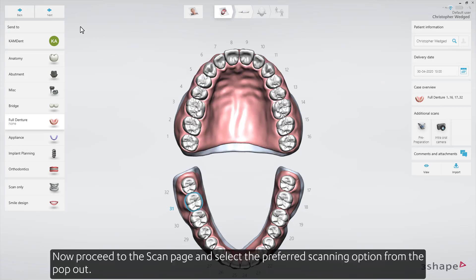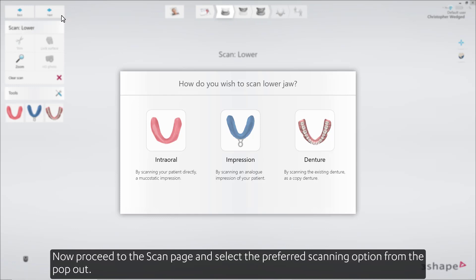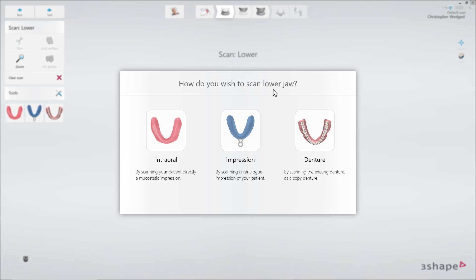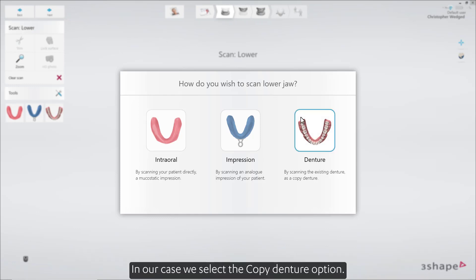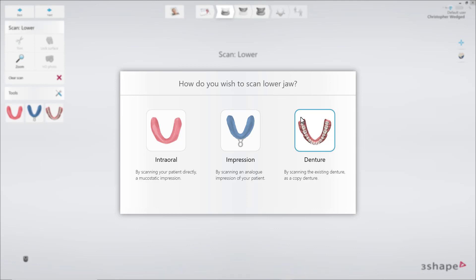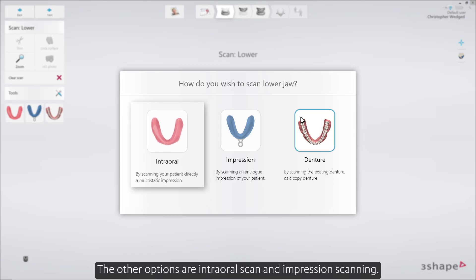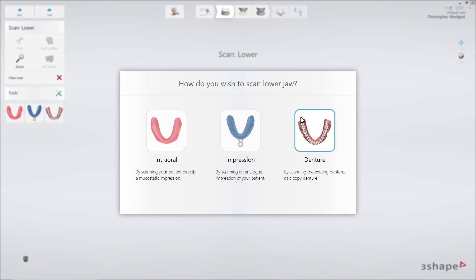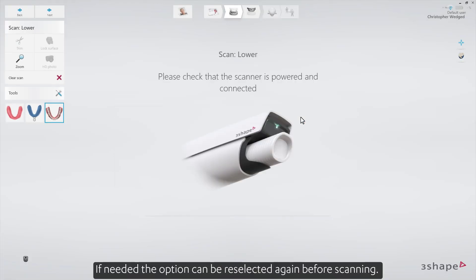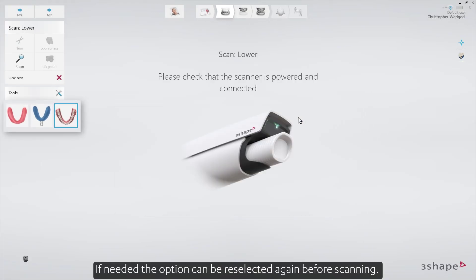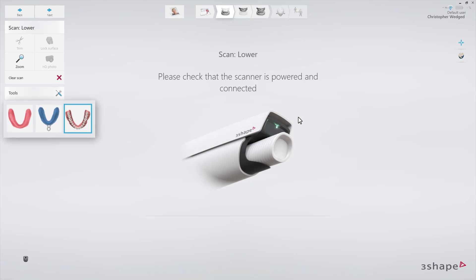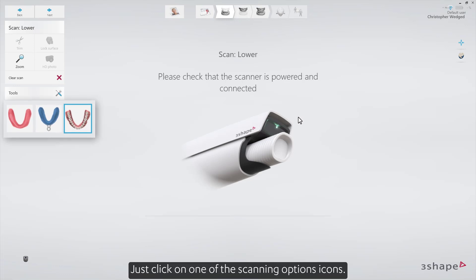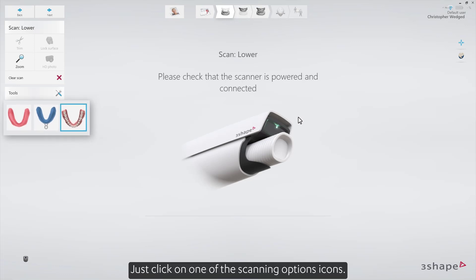Now proceed to the scan page and select the preferred scanning option from the pop-out. In our case, we select the copy denture option. The other options are intraoral scan and impression scanning. If needed, the option can be re-selected again before scanning — just click on one of the scanning option icons.